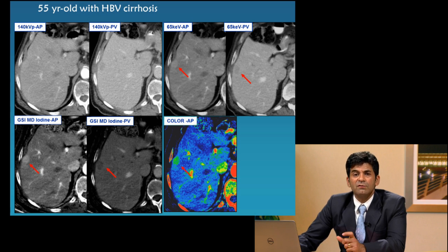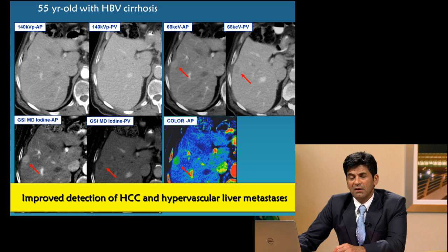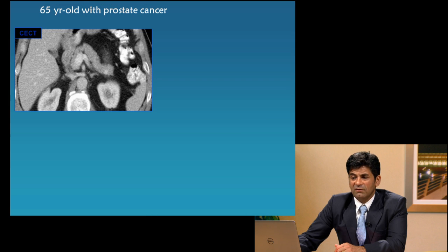There is less of a question of the arterial phase enhancement, and even the washout is obvious. So this is a benefit of the technology for improved characterization of hypervascular lesions such as metastasis and hepatocellular carcinoma.